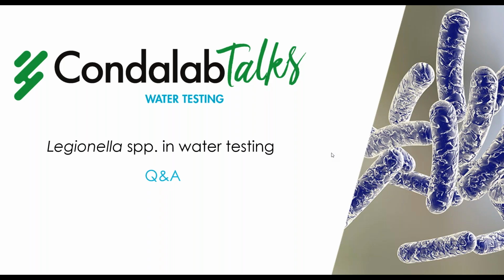Okay, so the first question: are there other alternative methods for Legionella? Of course, it's not only PCR, there are immunological detection methods. There are several tests on the market with different antibody markings, and the reading of the results also varies.